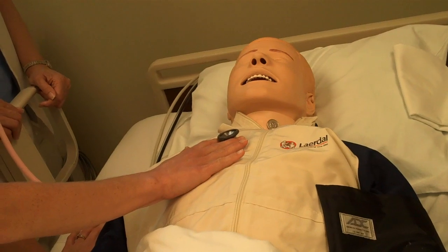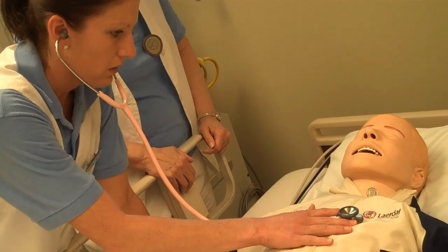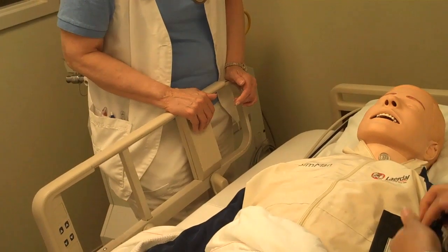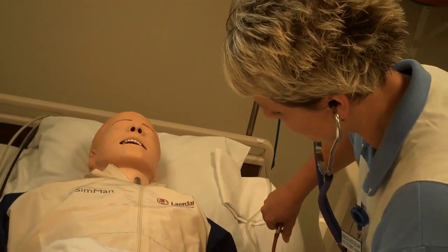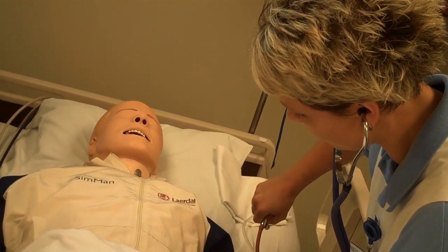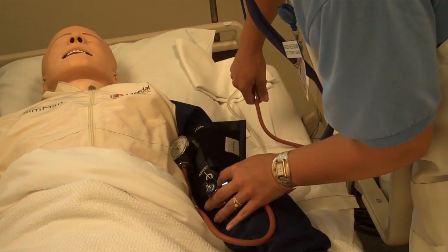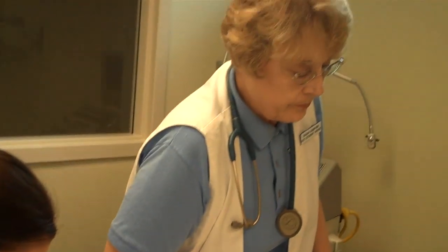'I'm so sick. I've never had pain like this before.' 'Do we want to start an IV?' 'We'll want to start an IV as soon as possible.' 'I'm going to attempt to get your blood pressure before we start that IV.' 'I'm quite nauseous.' 'We're going to get an IV going — that way we can get you some medicine.' 'When did your pain begin, Mr. Brown?' 'Blood pressure is 146 over 92.' 'A little prick from the needle.' 'IV's in. Pulses are good.'